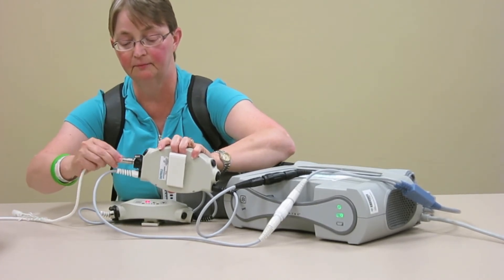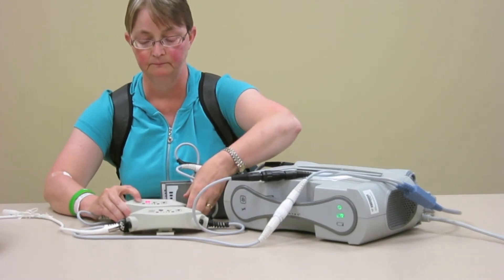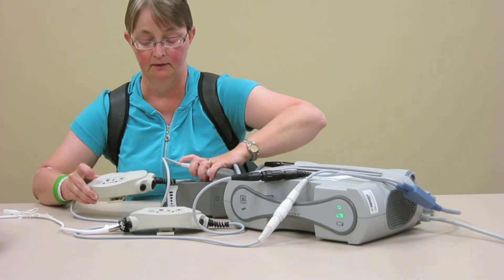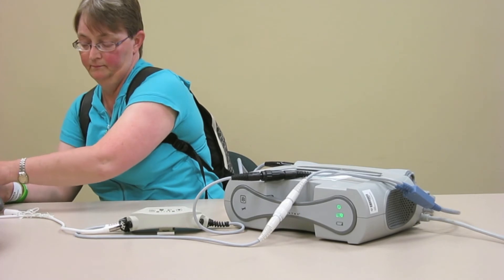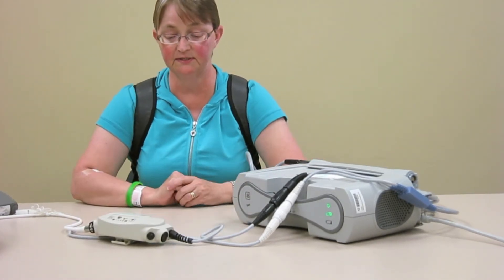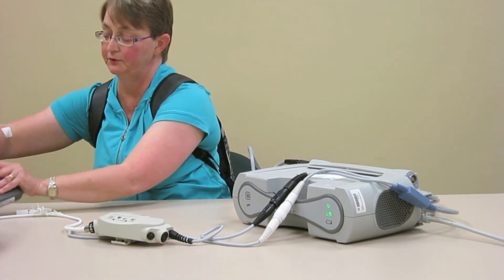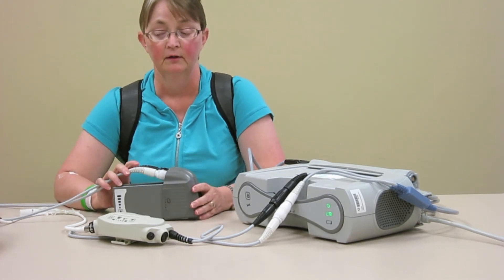Line up the black line with the black line, push this one in, and lock it. Silence that alarm again — you don't even need to worry about that one because you've disconnected it. Now you're hooked up to AC power. If you want to hook up to battery power again, it's nice and simple — just hook the new controller up to your batteries and you're ready to go.